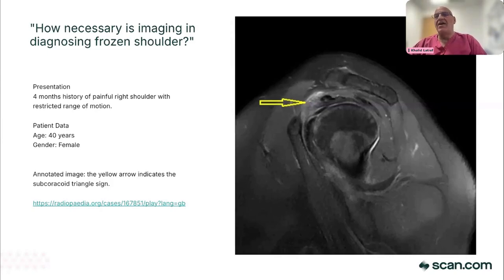But I sometimes get patients like this where the clinical information is not necessarily frozen shoulder, but just shoulder pain. And then I'll see some changes on MRI scan, like you pointed out there, some changes in the rotator interval, some high signal there, and also in the axillary recess, some high signal there on the T2 images. We can suggest the patient may have frozen shoulder, so the clinician can go back and examine them again. So correlate with the MRI, it works well. But frozen shoulder is self-limiting, it usually gets better by itself.